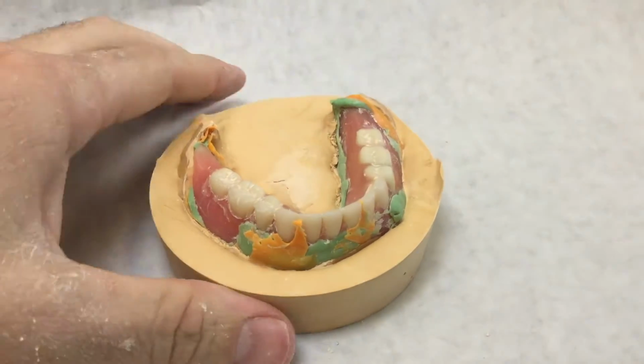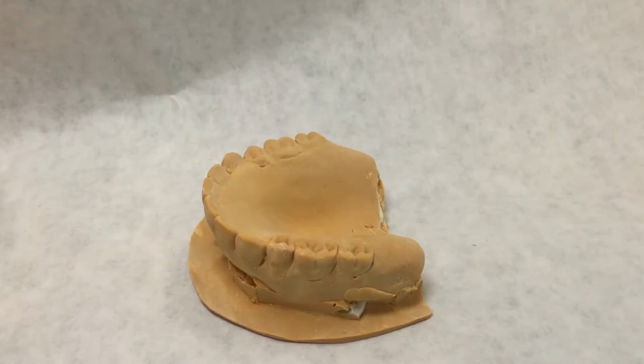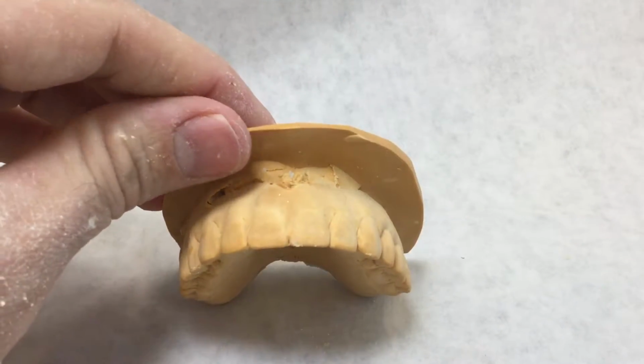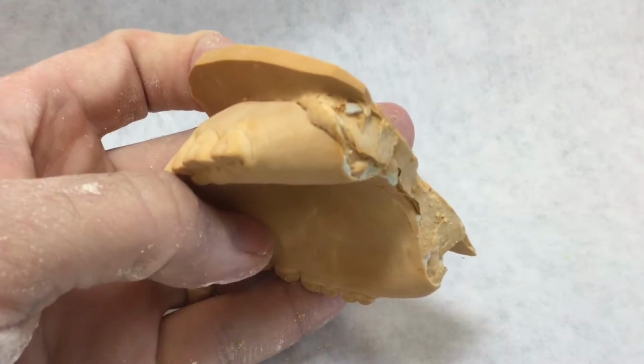An impression should be taken of the mandibular arch using the current lower denture as a custom impression tray. An impression should also be taken of the opposing dentition, whether natural dentition or a complete denture. And if needed, a bite registration should be taken to assist in mounting the casts.